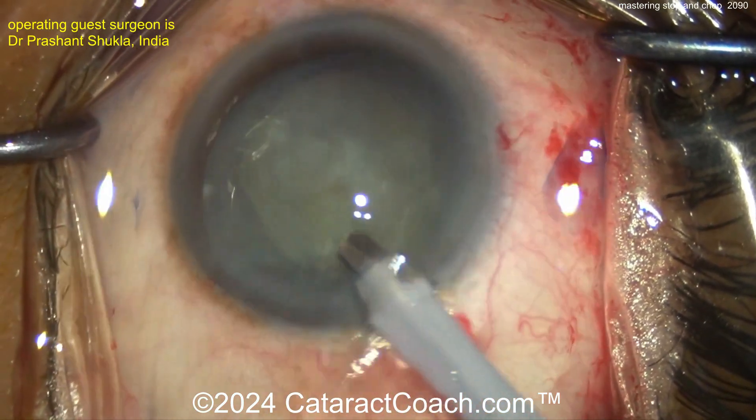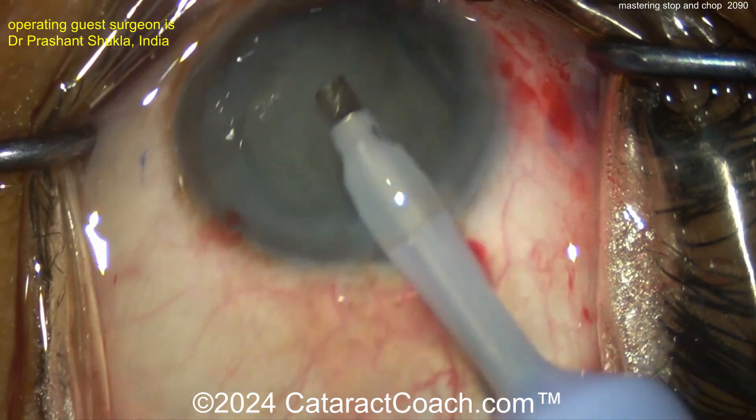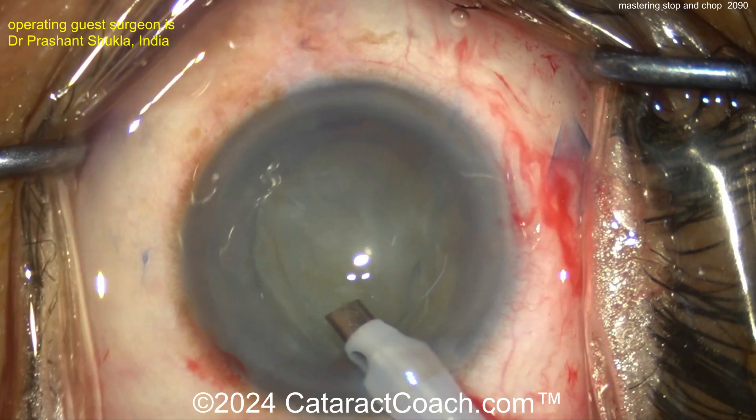It means you do that groove down the middle, you crack it into two halves, then you stop and switch over to the Chop settings, and then you do Chop for the second pieces to be removed.